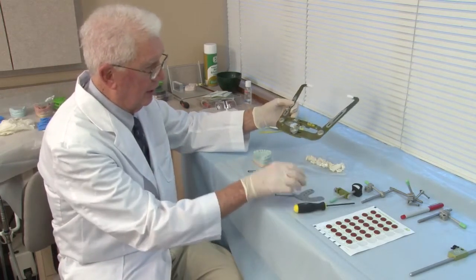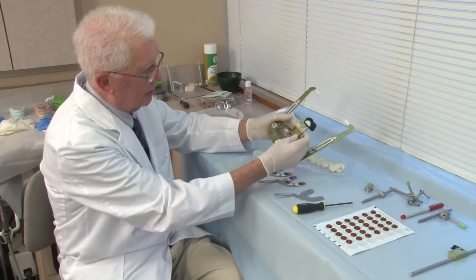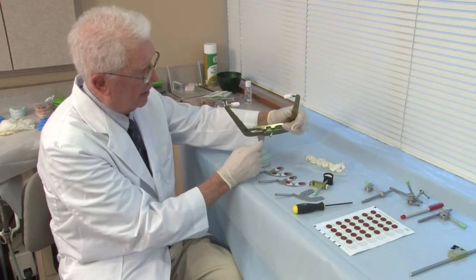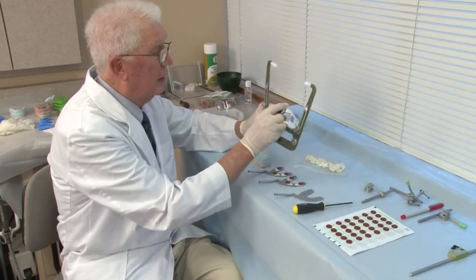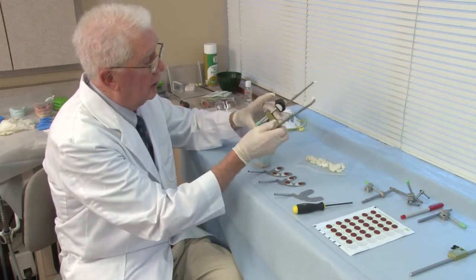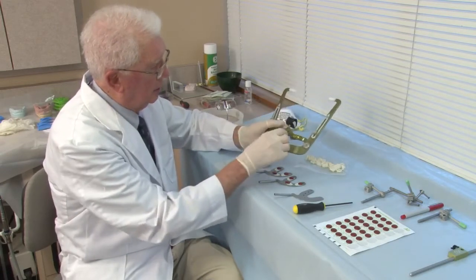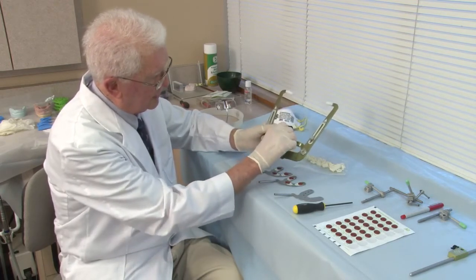In order, again, to have the face bow ready to go, have your Nasion relator in position. Remember that you have the slot here on the Nasion relator, and it goes into this slot on your ear bow. Tighten it good. Bring the Nasion relator all the way back and then tighten it.